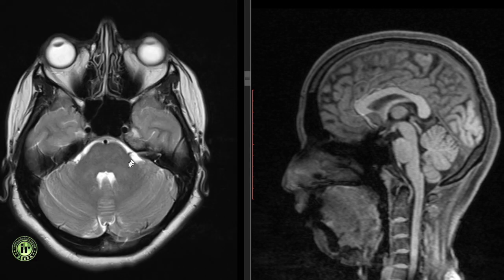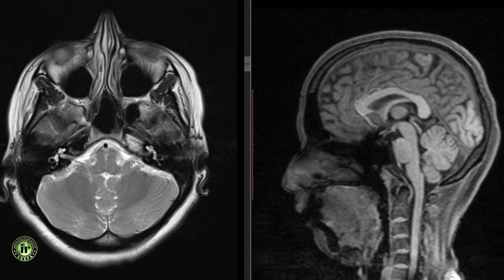The cerebellopontine angle cistern is limited medially by the pons, posteriorly by the flocculus of the cerebellum and laterally by the petrous bone. It transmits the facial and vestibulocochlear nerves, the anteroinferior cerebellar artery, the petrosal vein of Dandy and the trigeminal nerve in its anterior portion.